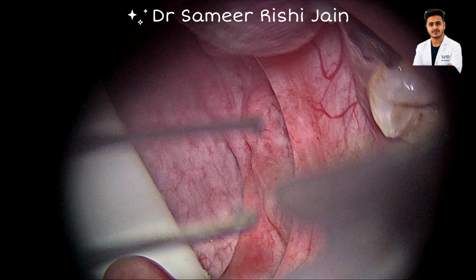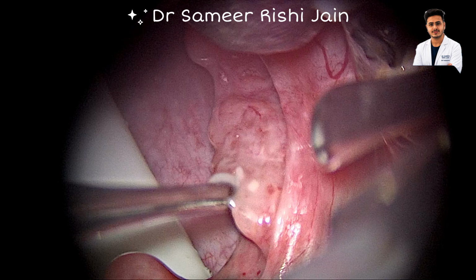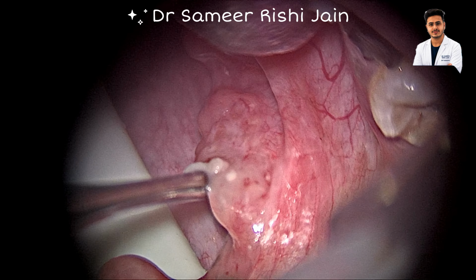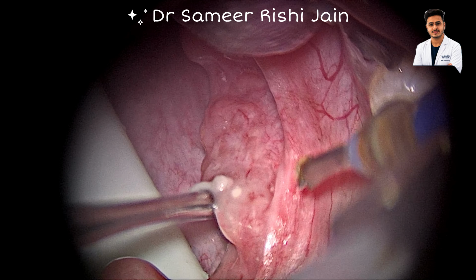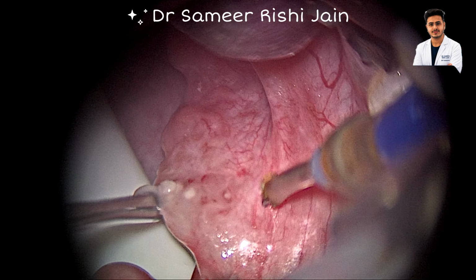This is a case of chronic tonsillitis in a 65-year-old female, and we are performing bilateral tonsillectomy with the help of a monopolar cautery. I am holding the right tonsil with the help of a toothed forceps. I am pulling the tonsil medially.